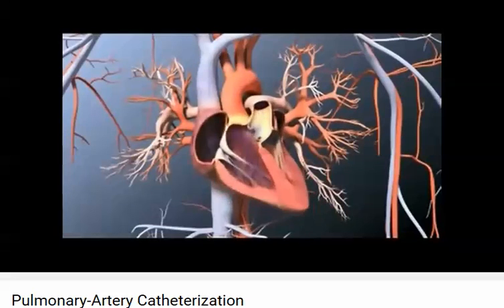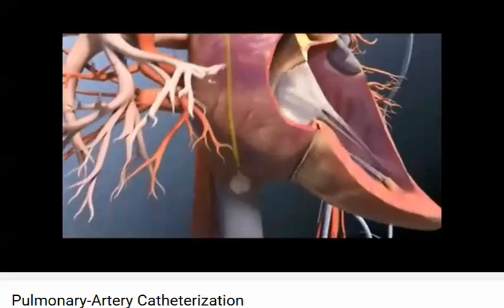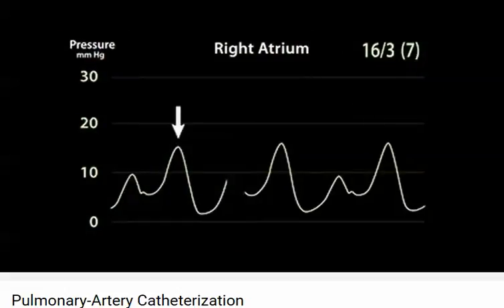Technical problems can occur during catheter insertion. If a right ventricular waveform cannot be obtained, the catheter may be coiling in the right atrium or exiting through the opposite vena cava. Tricuspid regurgitation may also be present and is suggested by large V waves on the right atrial tracing, which represent retrograde atrial filling.